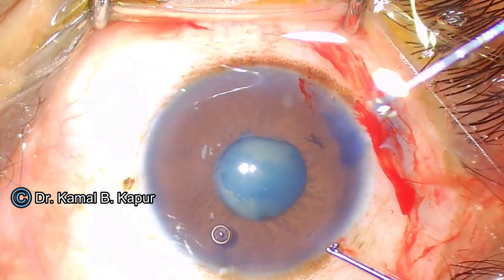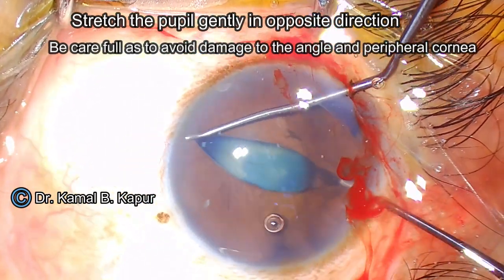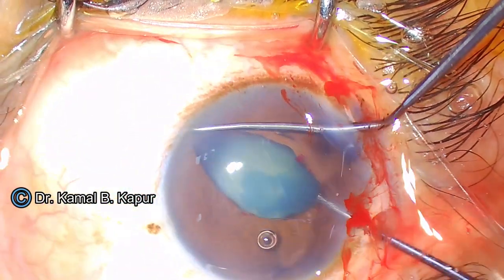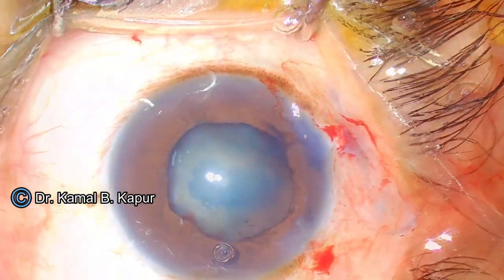Once we have broken the membrane, we use two blunt instruments: one is a Lester's manipulator and the second one is a blunt wire rotator. We stretch the pupil in a linear manner, but while we do that, we make sure that we don't injure the structures in the angle. And there you see, in a simple manoeuvre, the pupil has been dilated well to nearly a size of 5 mm.